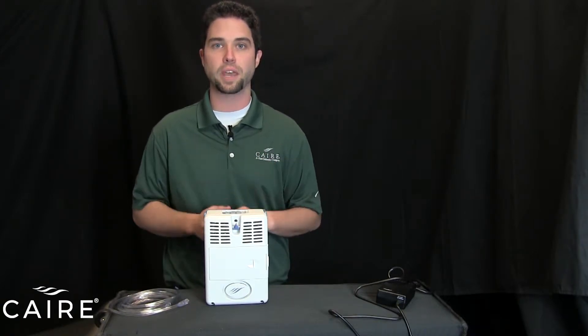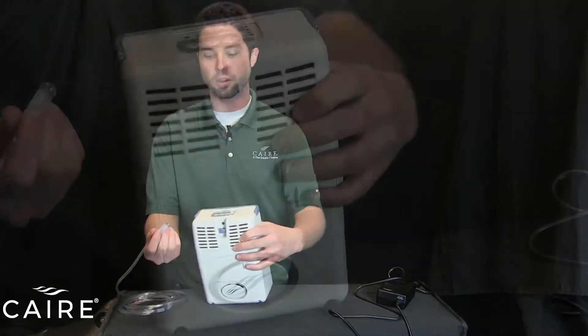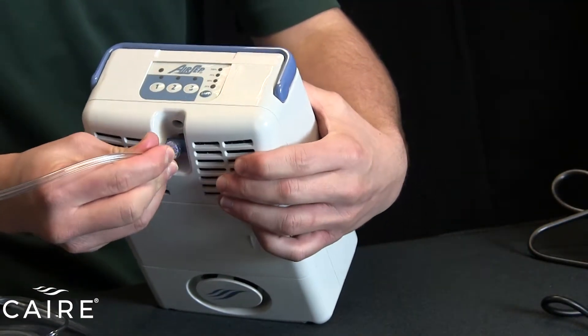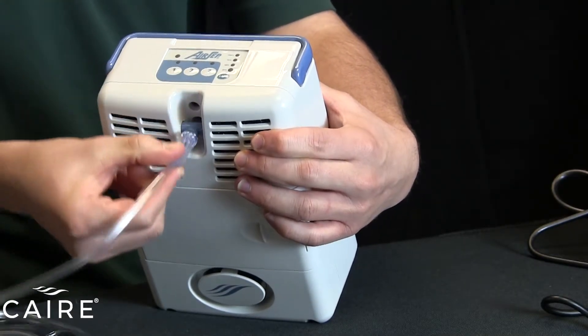The first thing you want to do is connect your nasal cannula. Simple connection on the top of the unit here just slides into place, and then for ease of movement, it will swivel as you move with the device.